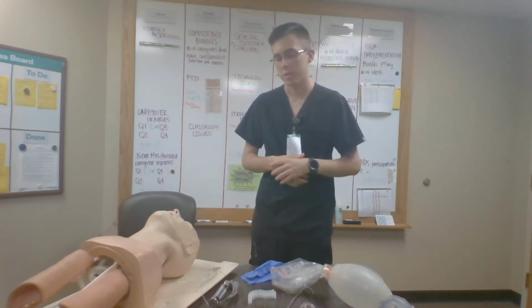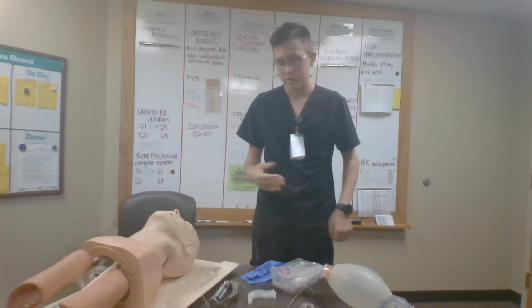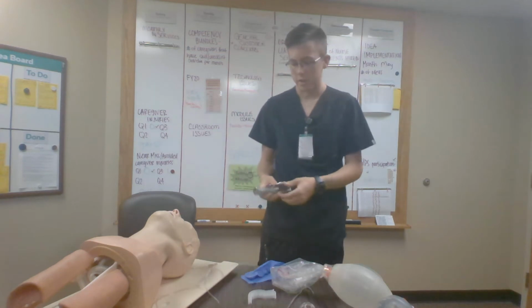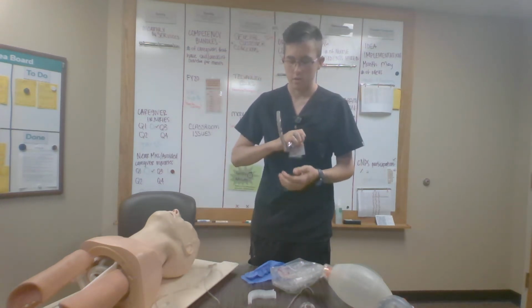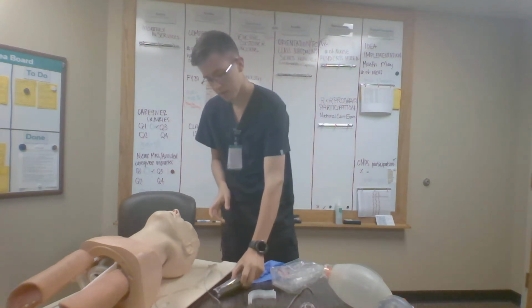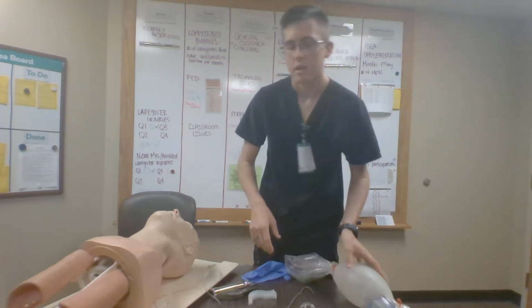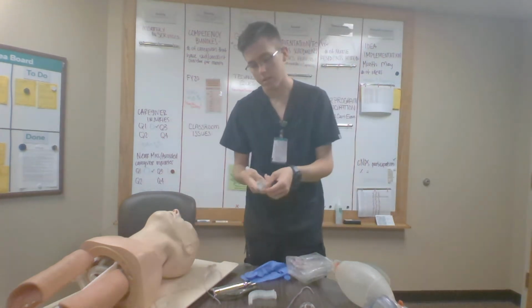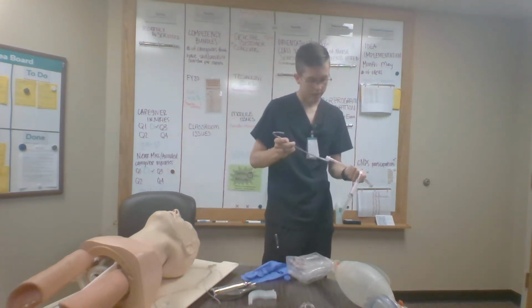trauma orotracheal intubation. The first thing that I want to do is gather up all my materials, such as my laryngoscope. So I want to make sure that my laryngoscope is properly fitting, as well as it turns on. Check it one more time. Okay. Then I also want to make sure that I have a BVM with a mask. I have a properly fitting ET tube with a stylet.